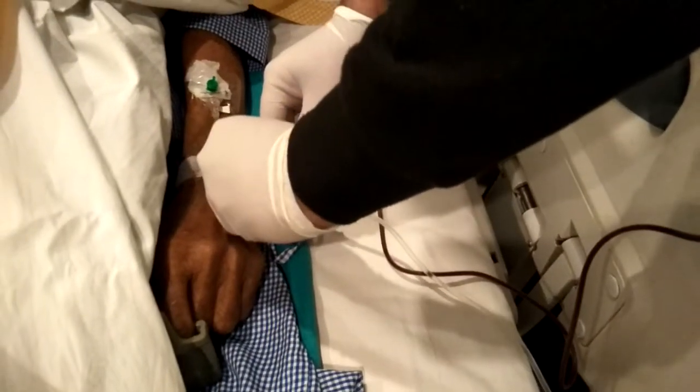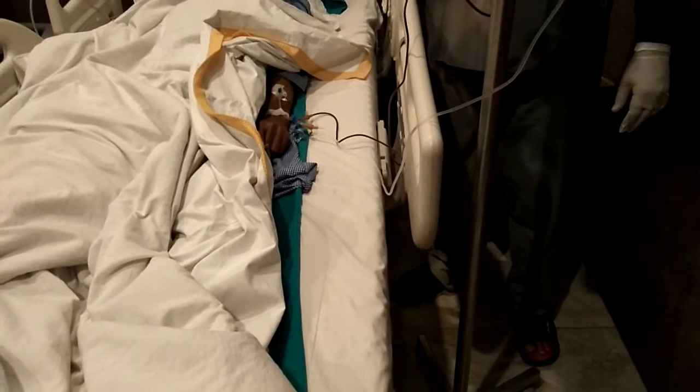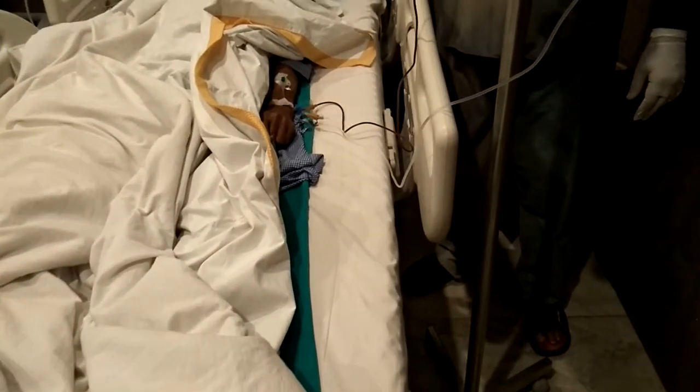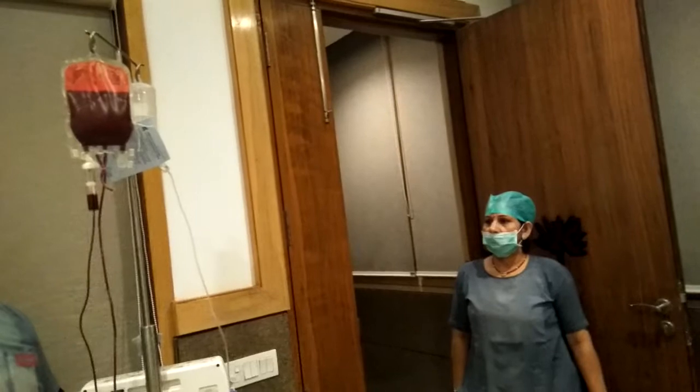See how the BT set is going to be used. There is a filter here already. See how to cut this blood bag from that side — the proper way is removing that one. Now we're opening here, and he is going to put this spike inside it — light hands, very soft hands. Some people do it halfway, but you need to put it in fully. This is packed red cells, and sometimes it leaks a little.